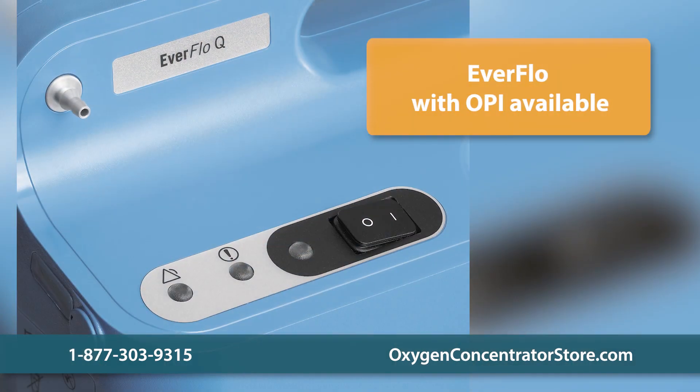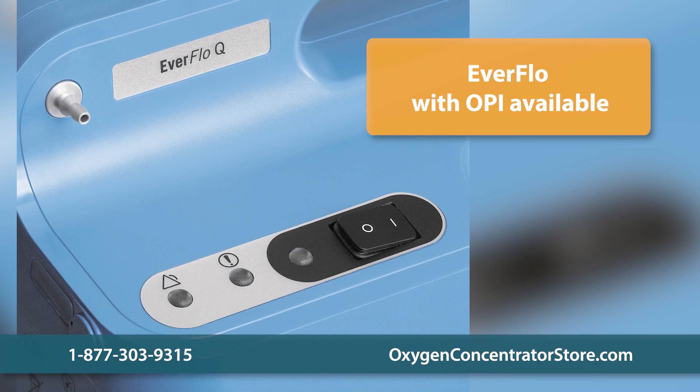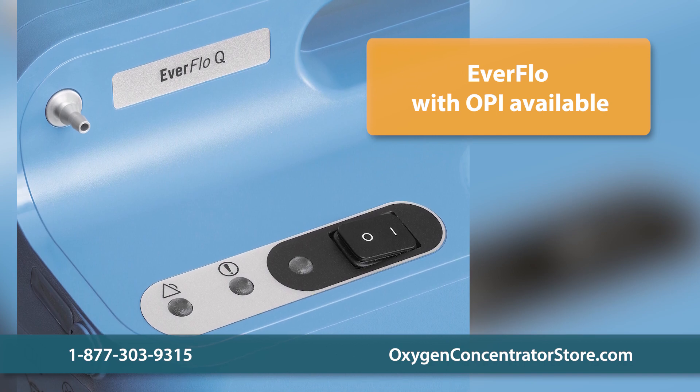We also carry the Respironics Everflow with an oxygen percentage indicator. This feature ultrasonically measures oxygen purity output and sounds an alarm if oxygen purity falls outside acceptable levels.